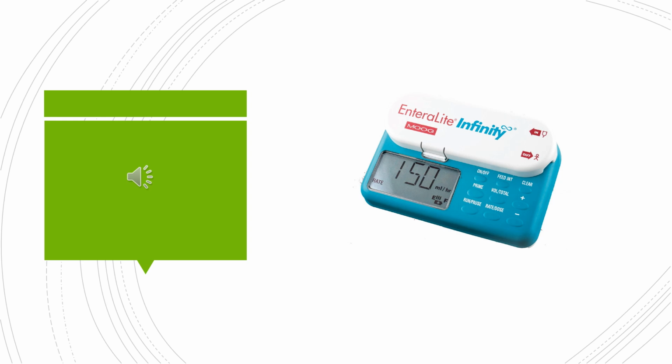Whenever a new feeding bag is used, we must thread it through the pump and make sure that the tubing is fully primed with feeding before attaching to our clients. There is a button for priming tubing located on the front of the pump, and never prime a pump while still attached to a client.